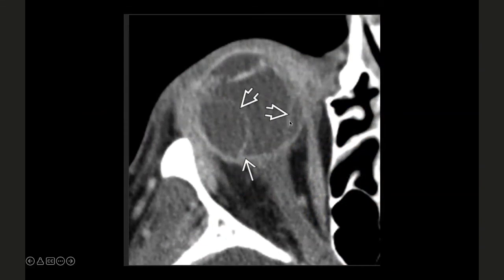Am I going to come and tell you guys this is streptococcal infection or Pseudomonas infection? No. I'm just going to tell you I see these exudates. It's probably going to be some sort of an infection, right? And then the ophthalmologists, they're really good at putting these together, so they know exactly what I'm talking about. And of course, now the neurologists too, right? But finding this much, we all can do in the imaging.